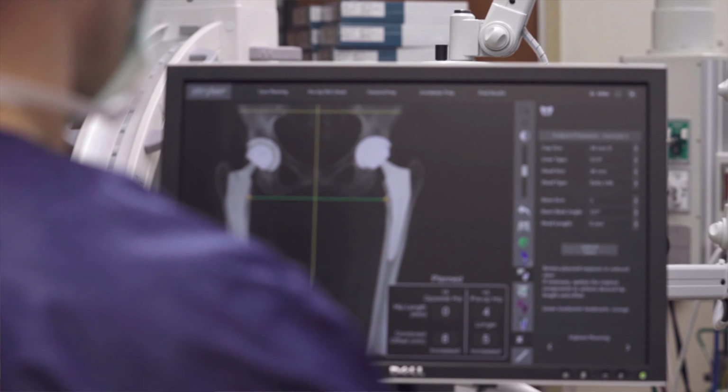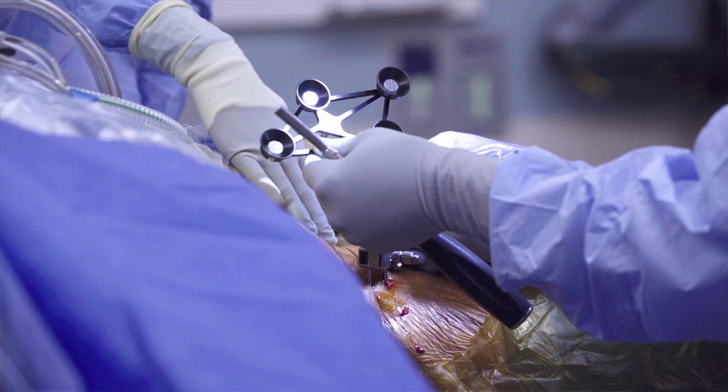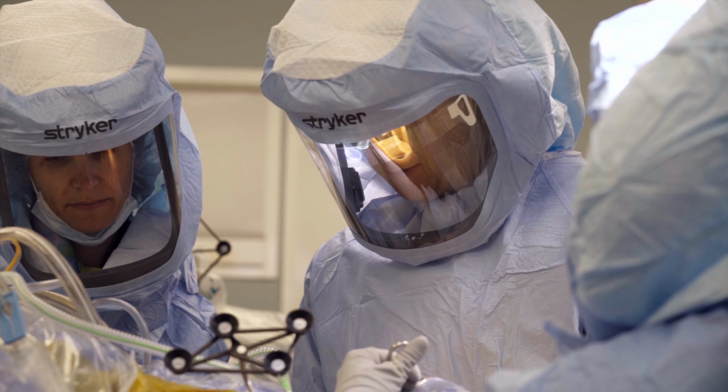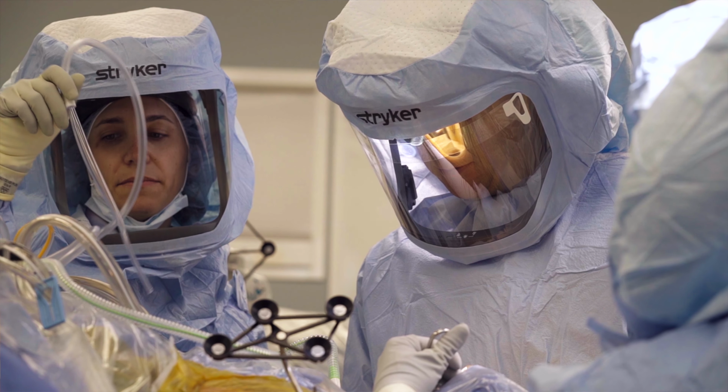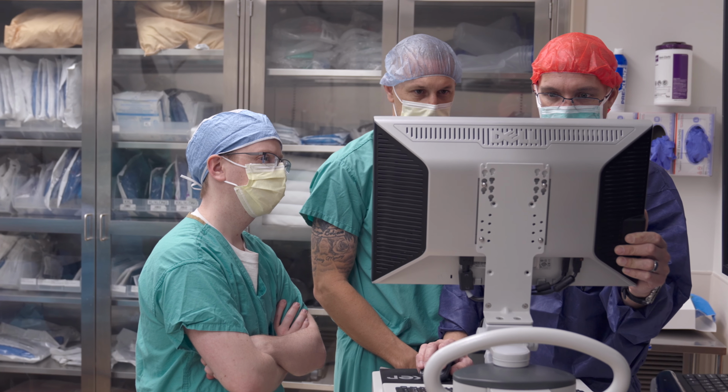The two goals of a hip replacement are to establish or reestablish the length of the limb and what's called the offset, or the lateralization of it. Well, I started losing my satisfaction with just eyeballing it on an x-ray. And I've always used the robot for knee replacements or partial knee replacements. So we started looking at it with the robotics for the hip, and they had a new stem coming out that was going to be much improved and a little different, and they had a new software coming out.